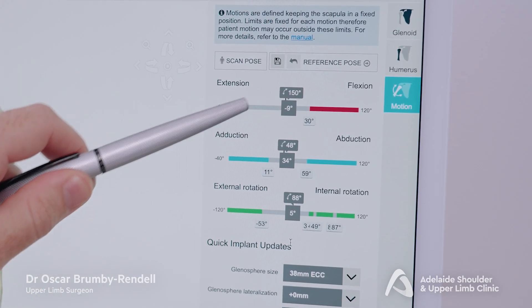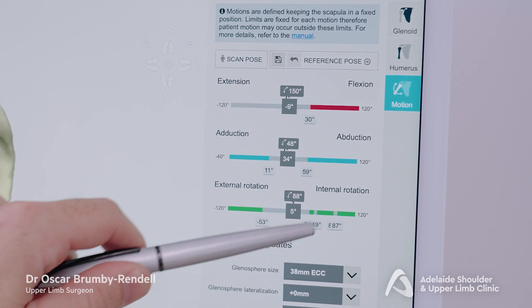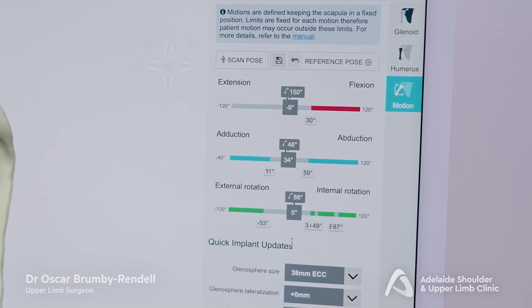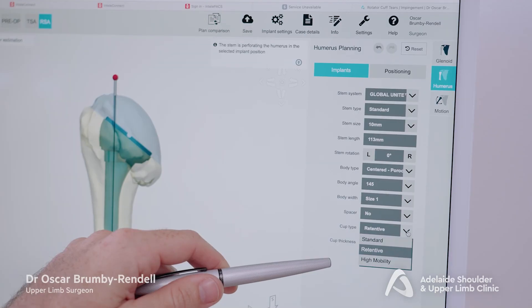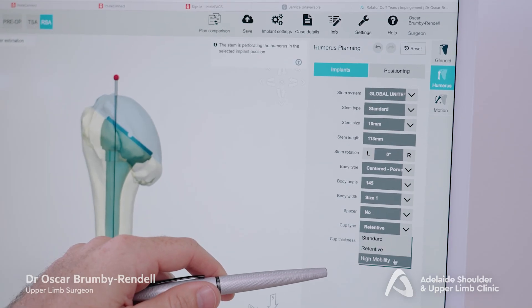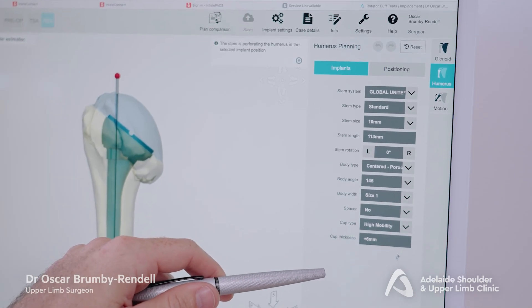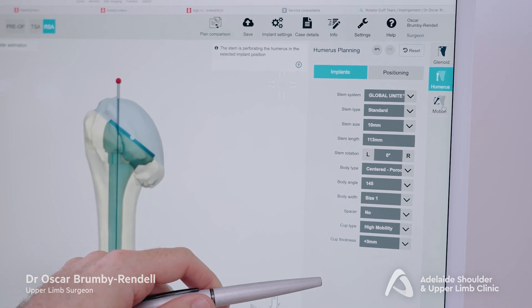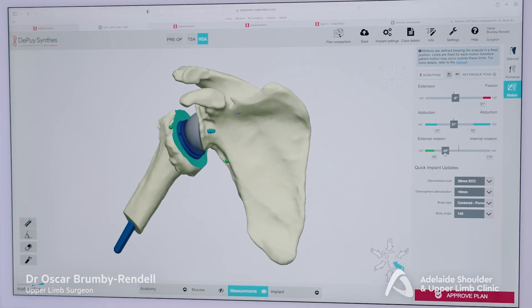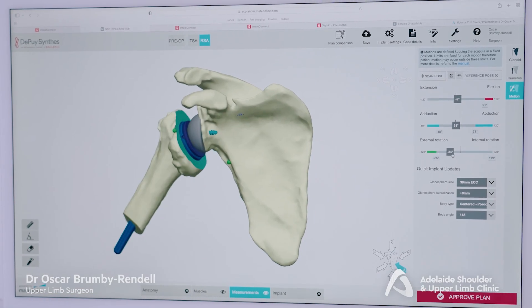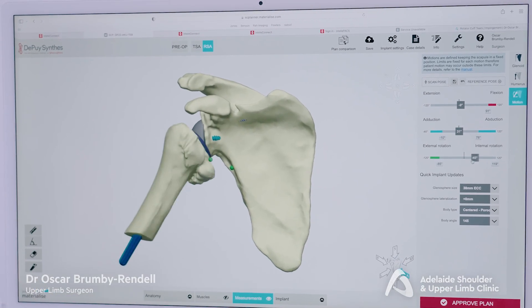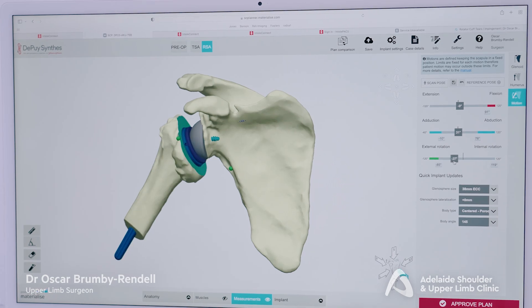This area here tells me the current arc of movement before bone impingement. If I change the bearing plastic component here to a different size, we can then analyse the effect on range of movement. Now the external rotation has increased — a potentially worthwhile change.